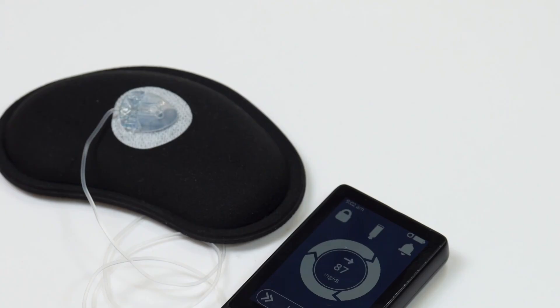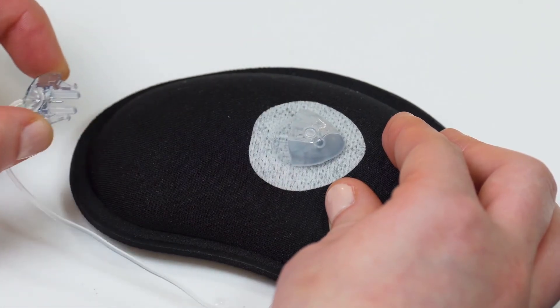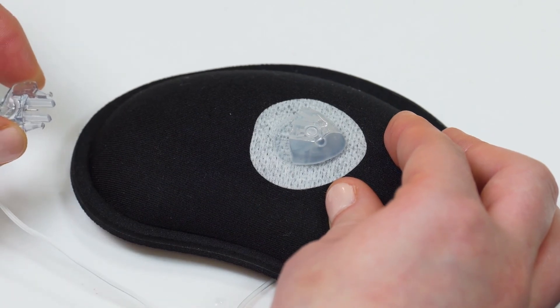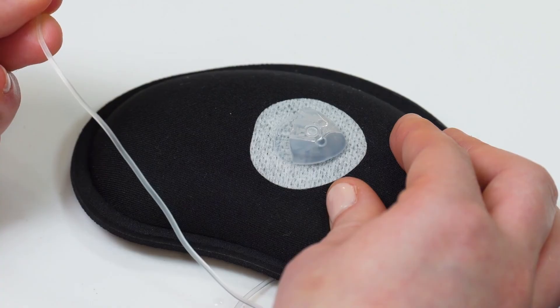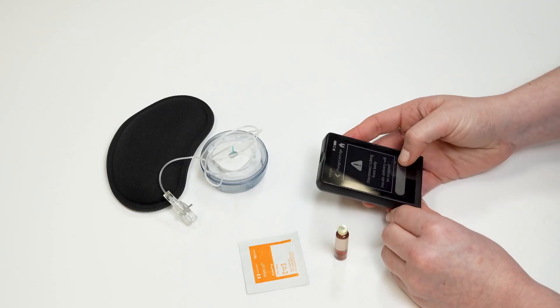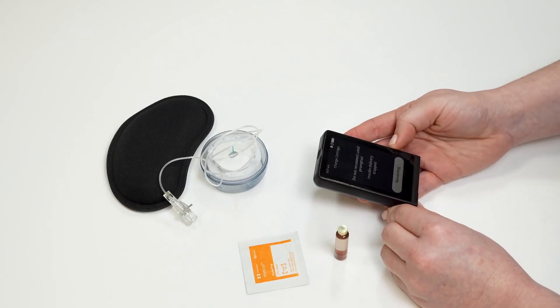When you have completed the process, your eyelet will automatically resume insulin delivery. Remember to disconnect from your eyelet at your infusion site base on your body whenever you are changing the cartridge or filling the tubing. Rewind the eyelet before you insert the cartridge, and insert the cartridge before you attach the eyelet connect.